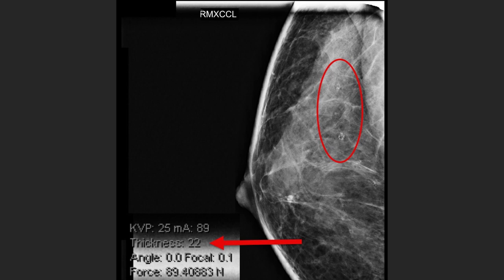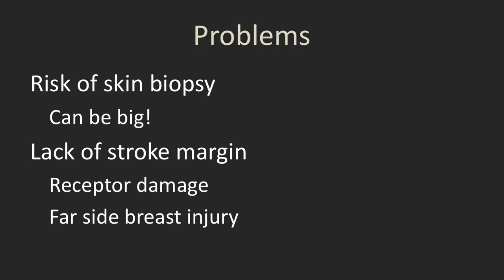This is a patient I biopsied last week who had several groups of microcalcifications up here. You can see that her breast thickness is only 22 millimeters. Generally speaking, below 30, 35 millimeters, you start needing to modify your technique.